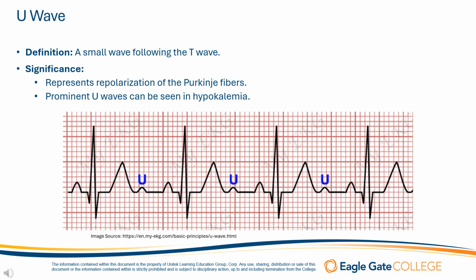Now let's look at the U wave. This is a much lesser known but still significant part of the ECG that provides additional insights into cardiac function, particularly in the context of electrolyte imbalances.